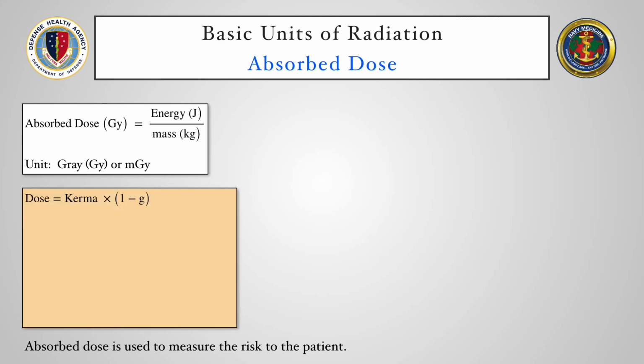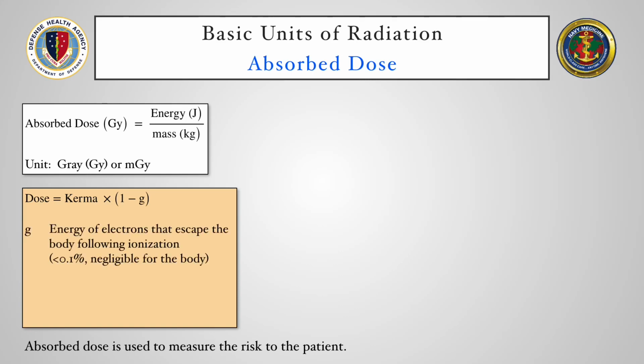The energy that escapes is captured as the variable G, which for diagnostic X-rays, that value is very small, less than 0.1%. So, for diagnostic X-rays, we can assume that dose is the same as kerma. They're basically the same value.